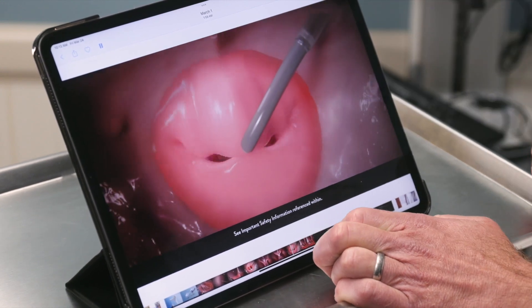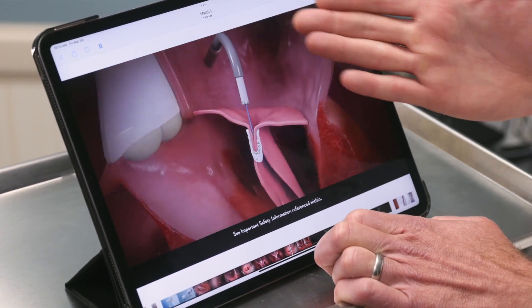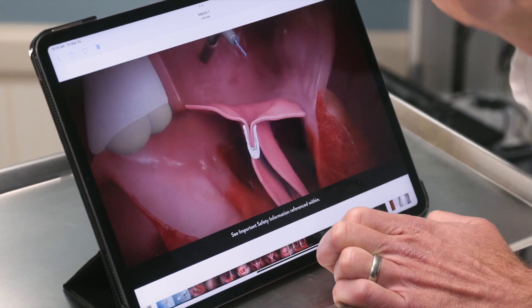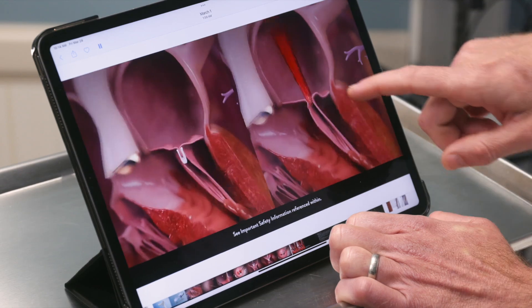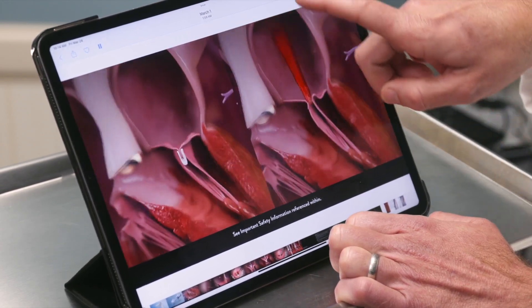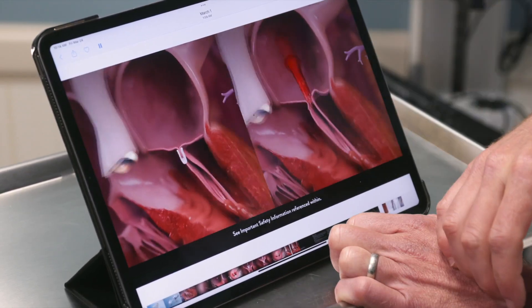Blood flows right in around the device, and we can check this out on echo. Once we're totally happy, we leave the device — it becomes part of the heart. This shows that the leaky blood that was going backwards is now stopped, because we've restored the coaptation and have the leaflets touching again.